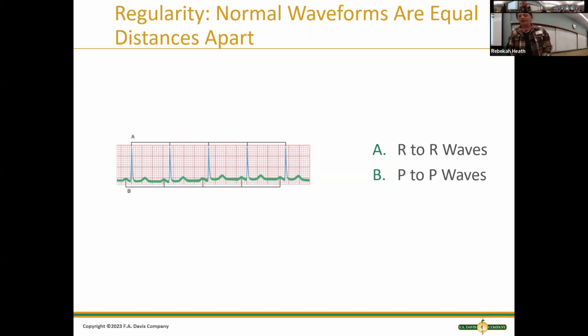All right, back when I was a young thing learning how to do EKG interpretation and measurements, we used calipers. I've never seen anybody with calipers, hardly ever, but it's like a little thing that spreads apart and it has two little sharp parts on it.